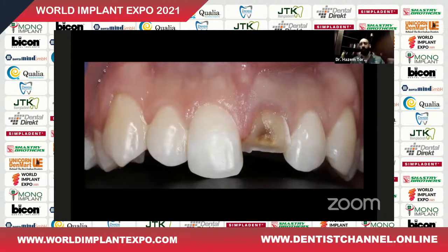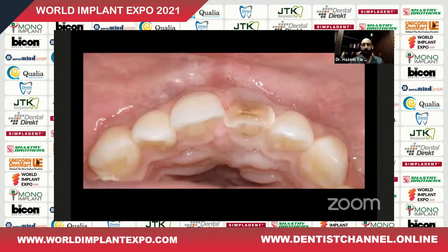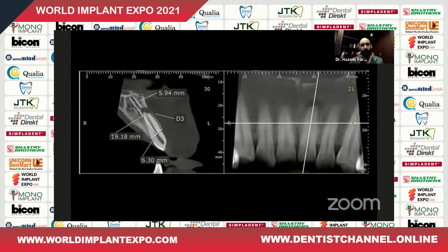Now, this is the initial situation, a young male that came in with a fractured upper central incisor, and we decided to go for extraction of the tooth. We can see that we have a periapical situation, and we had to deal with it. Today's studies, for example Wasdar, showed us that placing implants in infected sockets and non-infected sockets has the same success rate, as long as we clean the infection, debride the socket really well, and the patient is on an antibiotic regime. This is very important for the patient.